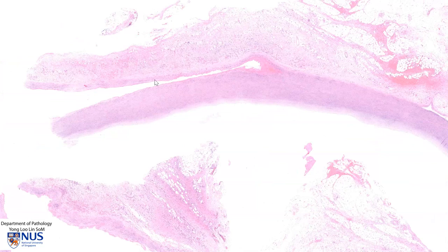What can happen to this aortic dissection? If the patient is very fortunate, the hematoma can actually track back through another tear in the tunica intima distally and re-enter the lumen of the aorta. This is fortunate because it would avoid massive bleeding.